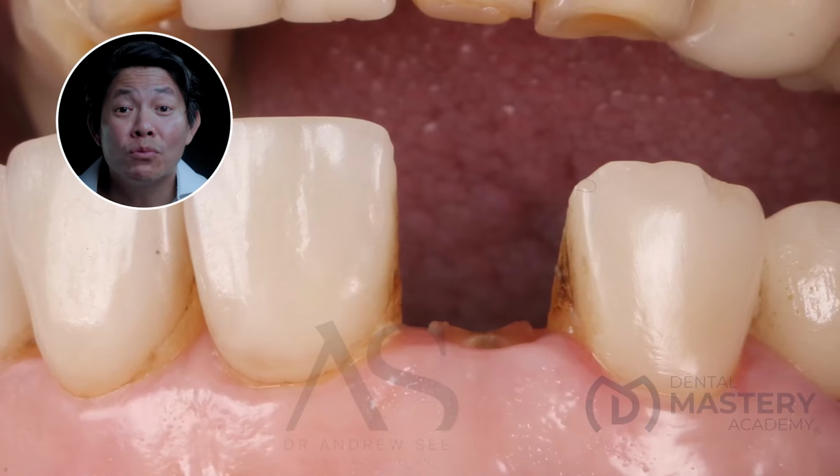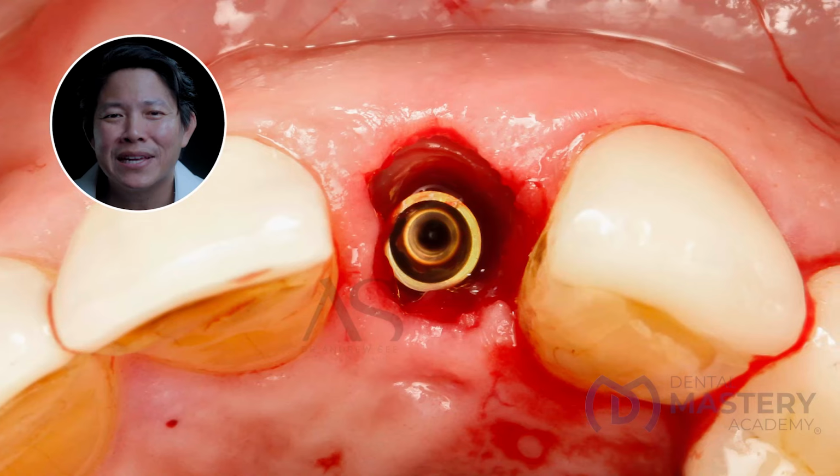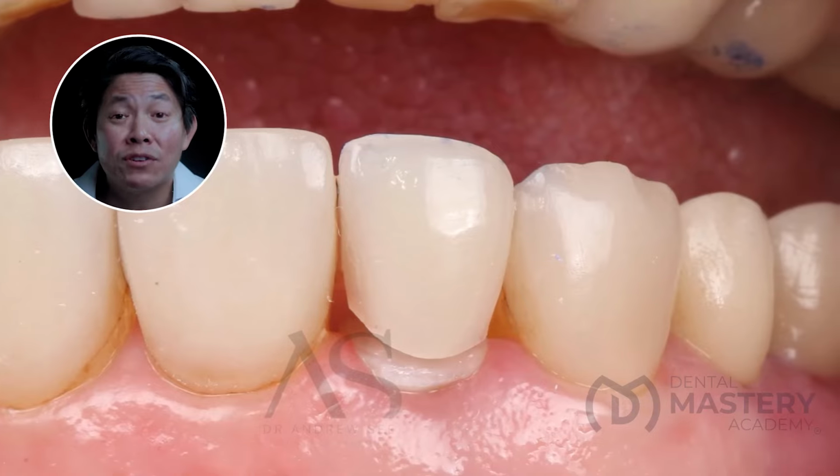After careful assessment and treatment planning, we decided that the best course of action was to do a bit of both. Essentially, I removed part of the tooth and left part of the tooth in place. I then placed an immediate implant behind this portion of the tooth, and then I made a custom healing abutment. The final implant crown will be made after full integration.